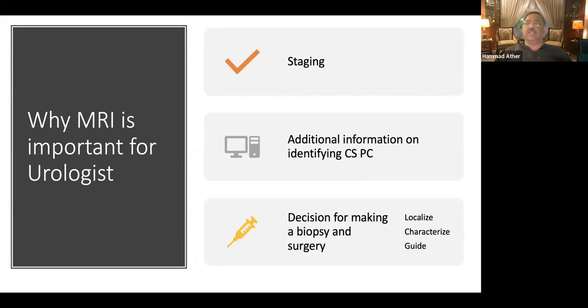And if you recall, last time when we were discussing MRI scan, we talked about PIRAD grading. And PIRAD grading is the one that helps us in knowing what is 4 and 5 cancers. And obviously these 5 cancers are aggressive cancers. Besides this, it also helps us in making decision for a biopsy and surgery. And these decisions are important not only in characterization of the lesion, localization of the lesion, and sometimes direct our biopsies by what is called a fusion biopsy using MRI and transrectal ultrasound.